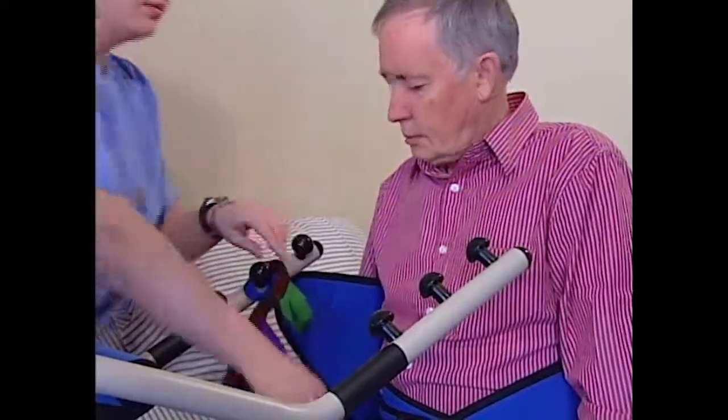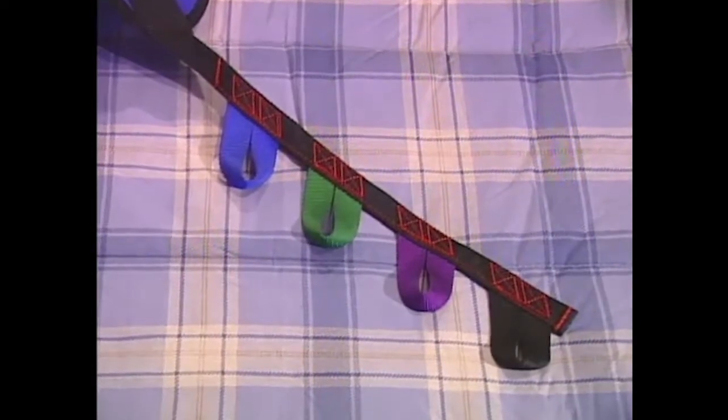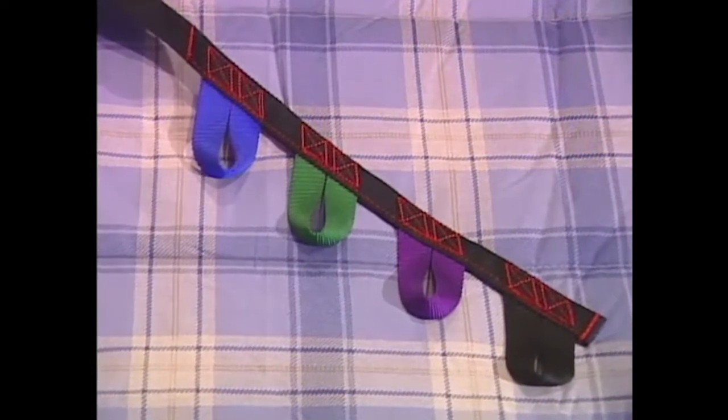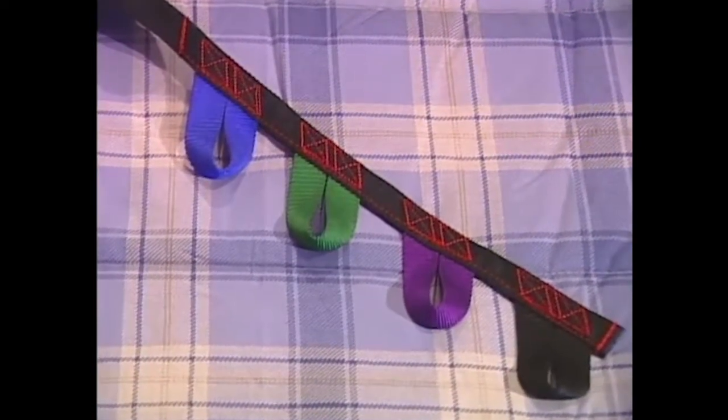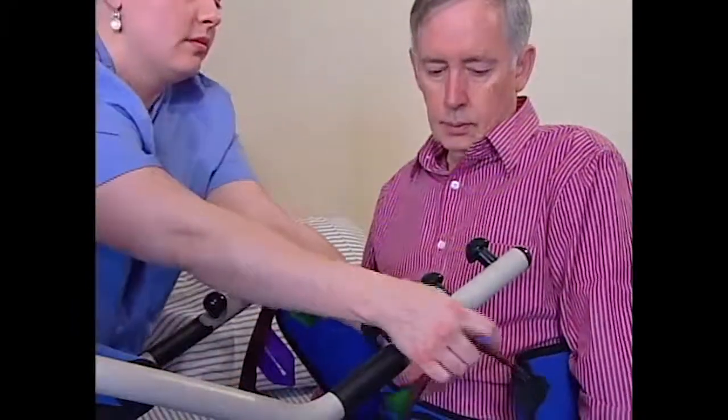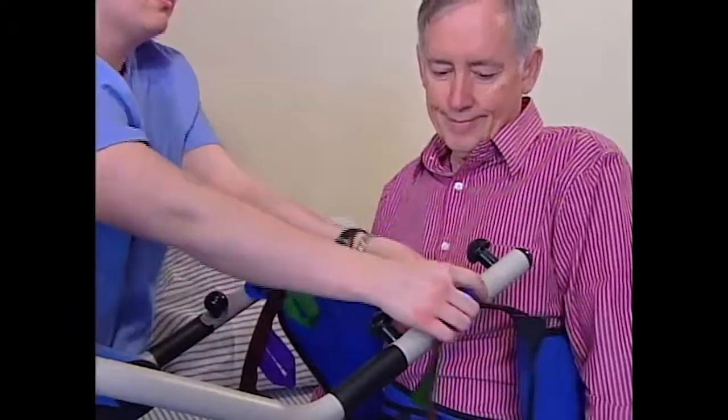Attach the sling to the lift arms. The straps on the sling have a series of color-coded loops sewn into them. Use the same color loop on both sides and choose the loop that most comfortably attaches without too much slack. This will make sure the patient stays comfortable and stable during the lifting process.